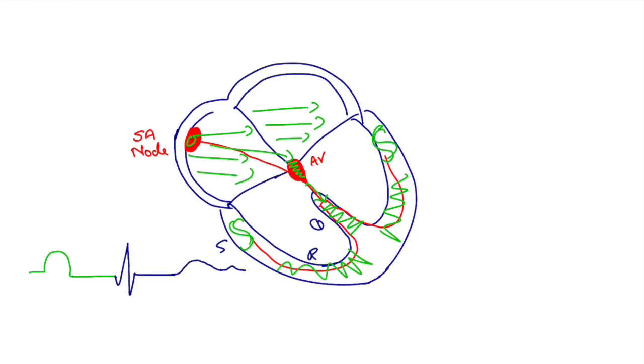which is nothing but electrical activity at the papillary muscles. The basic idea which I wanted to convey was that the P wave is formed by the depolarization of the atria, followed by the PR segment, which is due to the delay in the conduction through the AV node. Then the bundle of His, right and left bundles, and the Purkinje fibers are like highways, national highways.